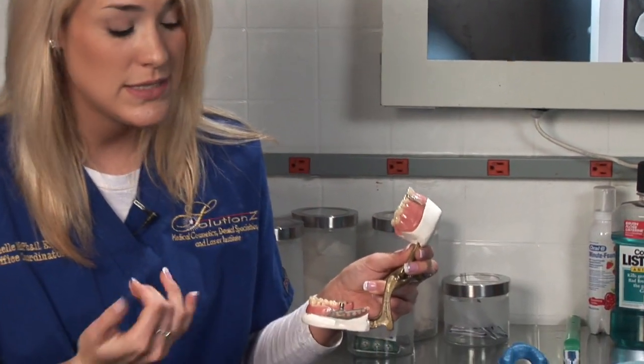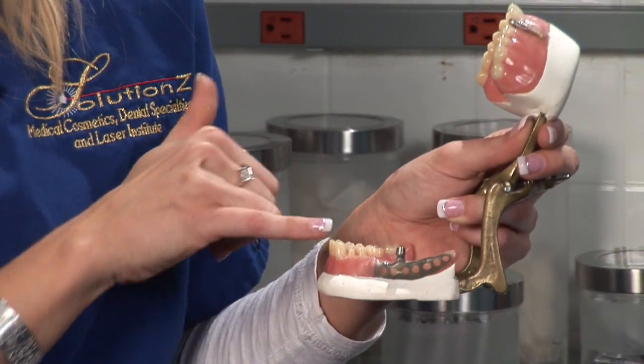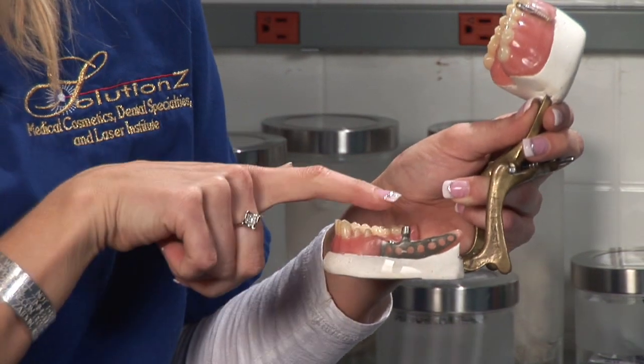When you have an empty space — either you've had the tooth extracted or the tooth is just missing — the two teeth on either adjacent side of it are reduced in size and shaved down in thickness.